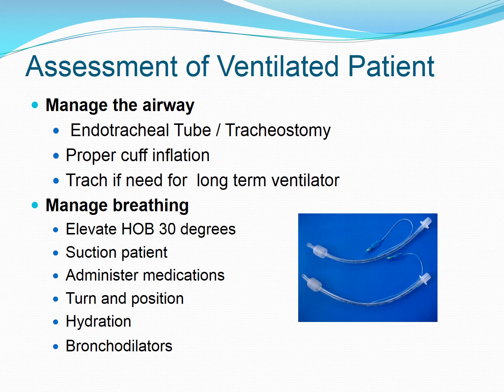Coughing is good. You've stimulated coughing in that patient, and that helps to mobilize those secretions. So then you want to pull that catheter out, but make sure you pull it out all the way. And so that's one of the things that you need to do.